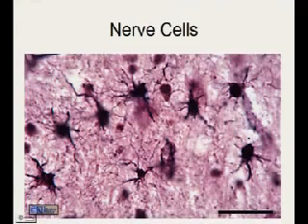But these are nerve cells. These are a typical picture of nerve cells in cross-sectional view in a histological slide. Again, you see the cell body, the axonal process, the dendrites that you can see located here as well. All a part of the nerve cells. You should be able to recognize this and identify them as either neurons or nerve cells.